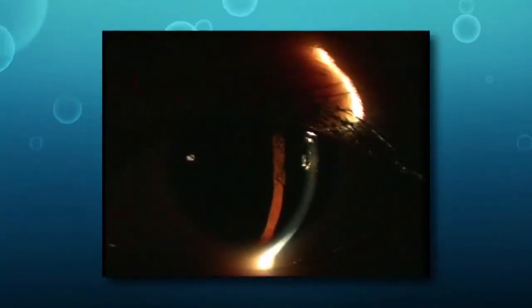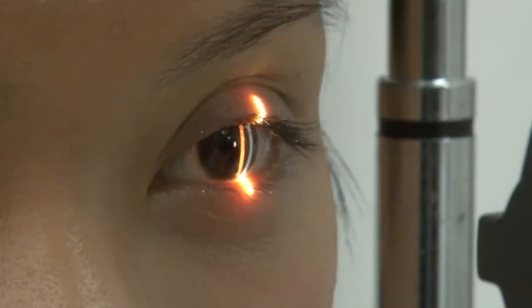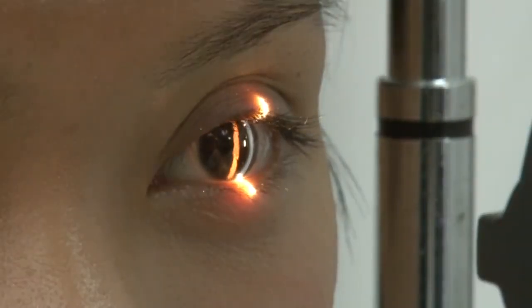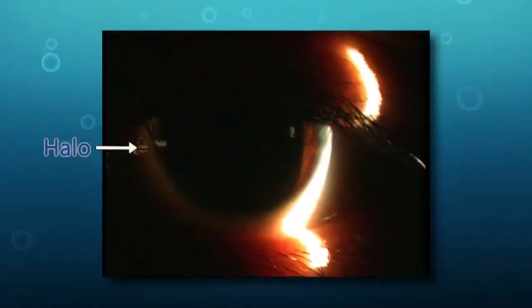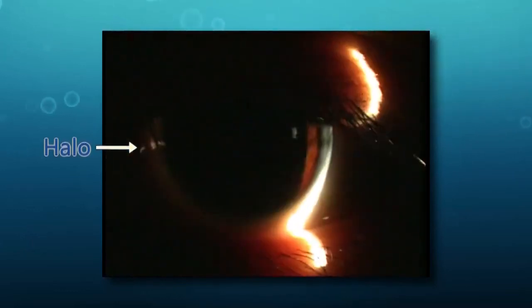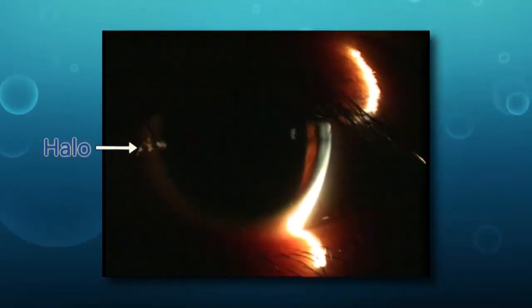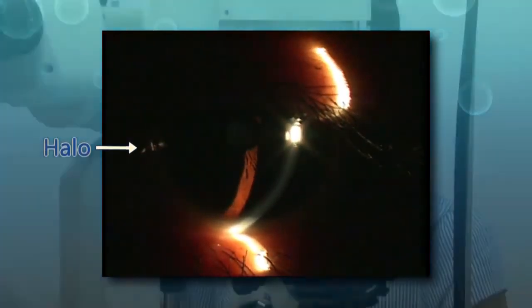First, focus on the cornea and set the magnification to low. Position the light source at about 45 to 60 degrees. Adjust the light source to about 2 mm wide and rotate it out of the click-stop position to illuminate the limbus area. A halo of light is observed around the entire limbus as the light is transmitted throughout the cornea. The normal cornea appears dark since the light is being internally reflected.